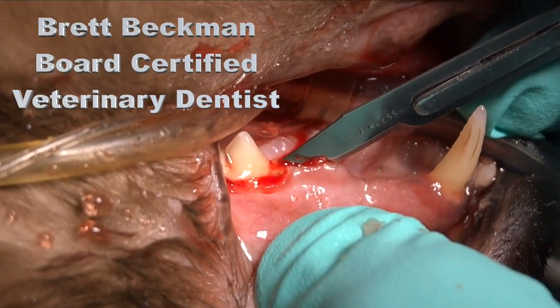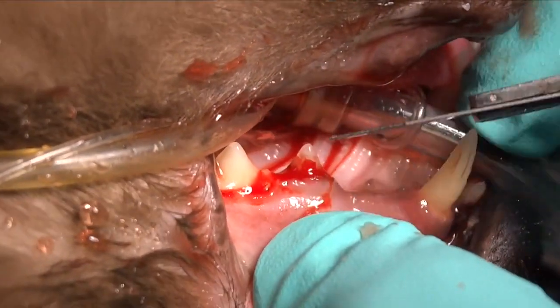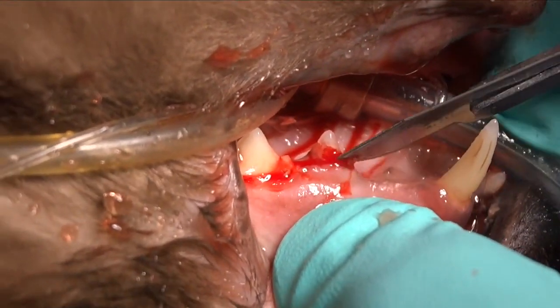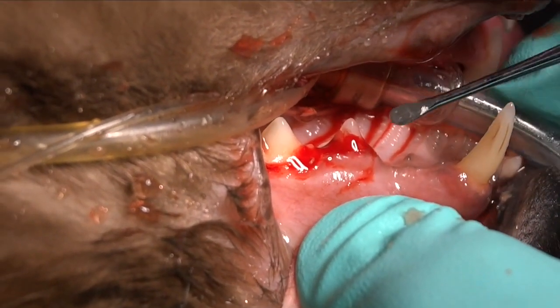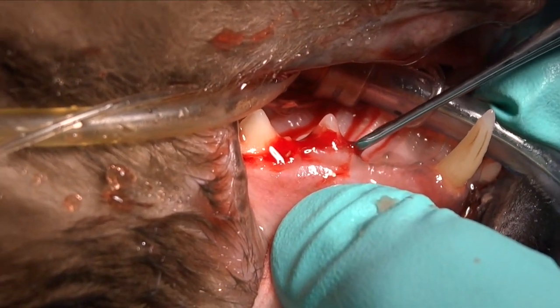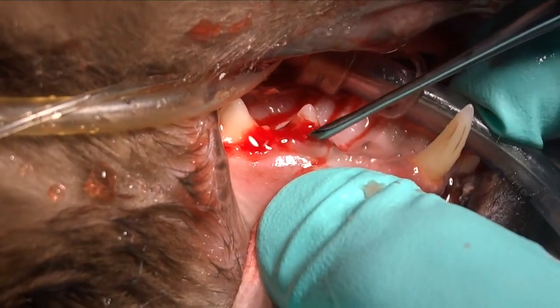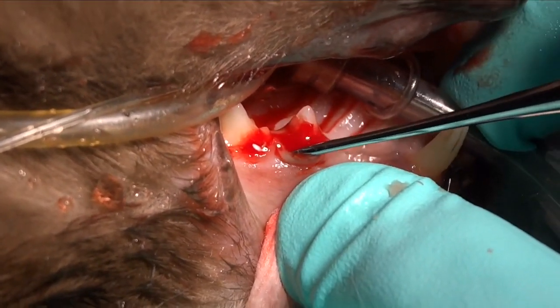We're working on the left maxillary third premolar and we start off by taking that scalpel down to the bone, just levering that gingiva off initially, and then we're going to come back with our periosteal elevator. This is the small end of a feline EX9 periosteal elevator and we're just going to increase the exposure there.